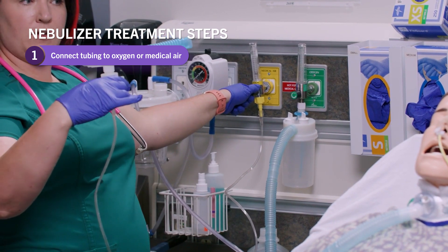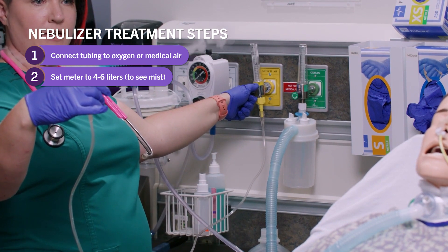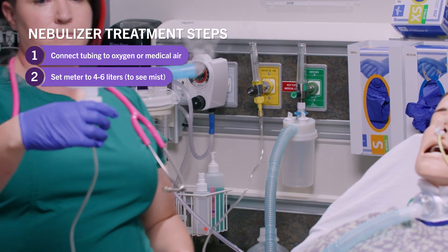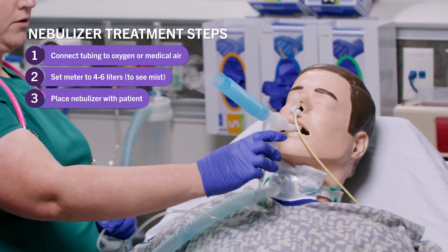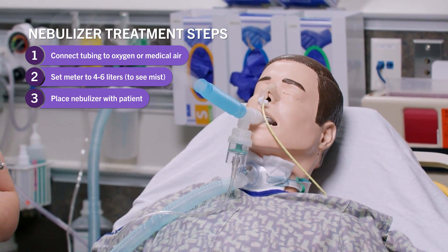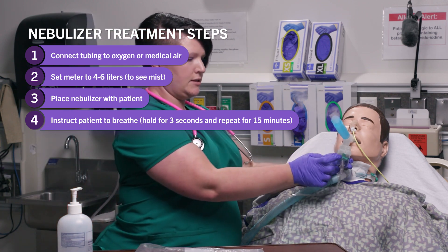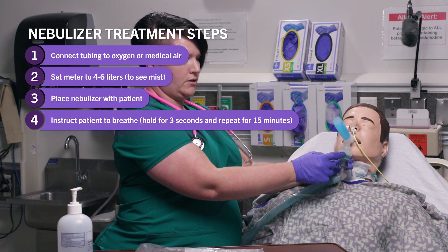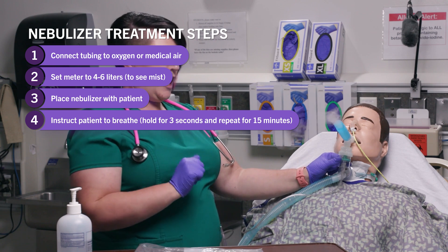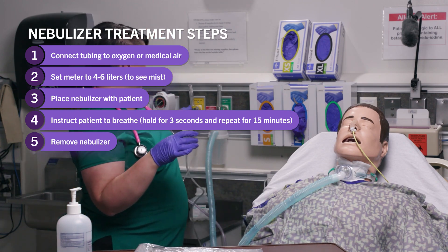I'm going to turn it up to four to six liters until I see a fine mist coming out. I'll place it into Mr. Jones's mouth and instruct him to inhale, hold his breath for three seconds, then exhale — continuing this treatment for 15 minutes. During those 15 minutes I will tap the container to make sure all of the droplets are being aerosolized into the mist. After 15 minutes I'll remove it and turn the medical air off.